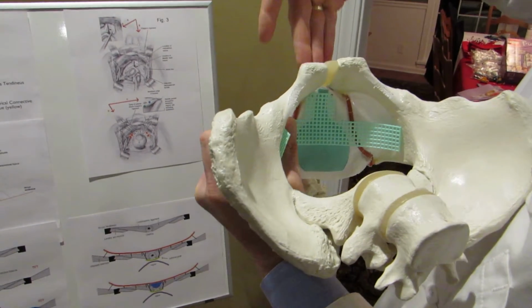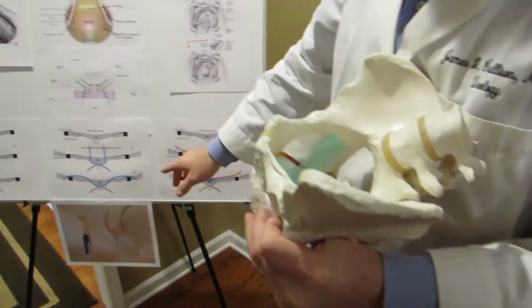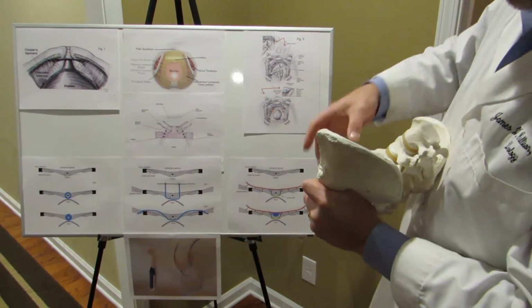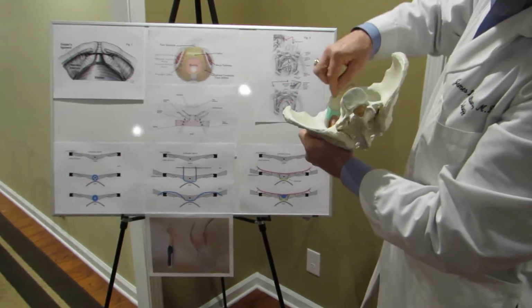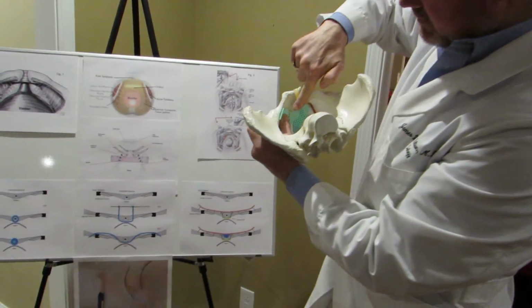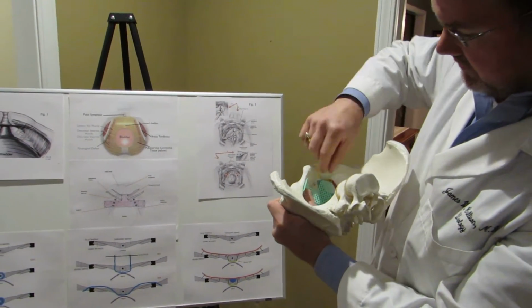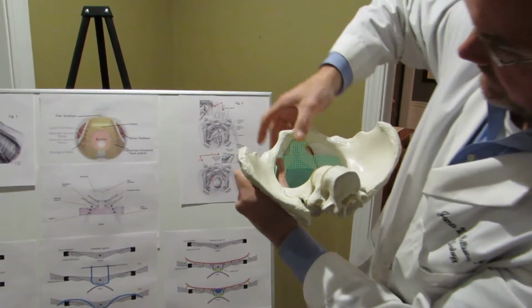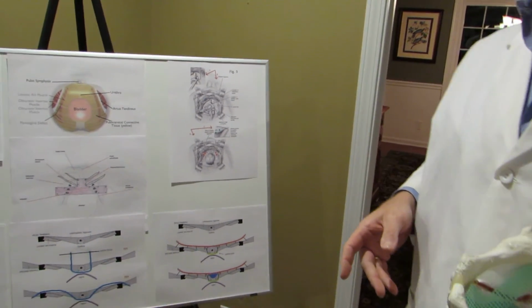Another transvaginal surgeon can be in this area with a pair of scissors, making a small incision, placing this opposing graft if they feel necessary. And basically at the end of the case, the surgeon can decide to cut this off, this extra material, or stitch it to Cooper's ligament or out to the obturator internus, and more importantly, make sure it's affixed to the arcus tendineus out here laterally to restore all this anatomy into its appropriate position.